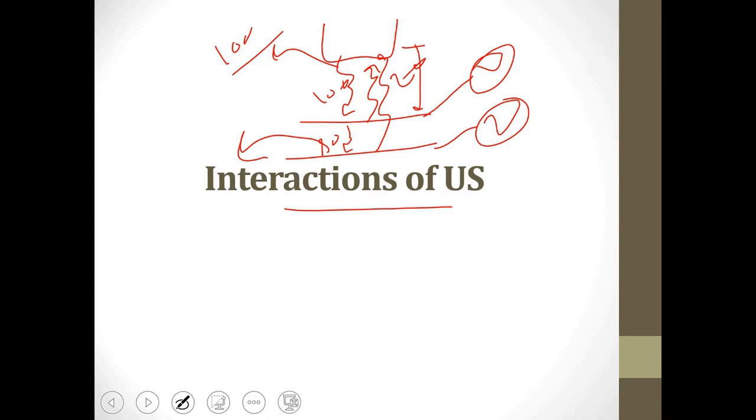Now, as a transducer, if I take this signal as it is, you will find that the upper part, the first signal coming to you, is good and homogeneous, meaning it is bright, while the signal coming from below is dark because it is weak. It has experienced attenuation.